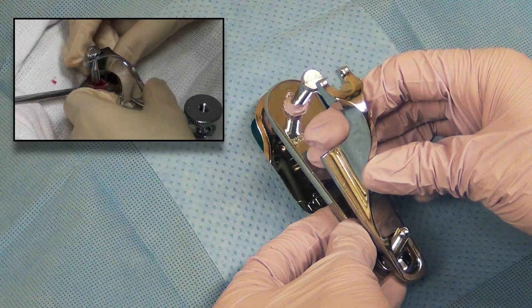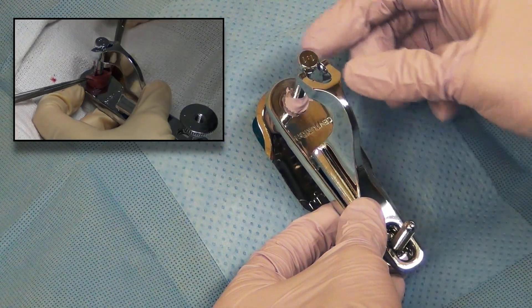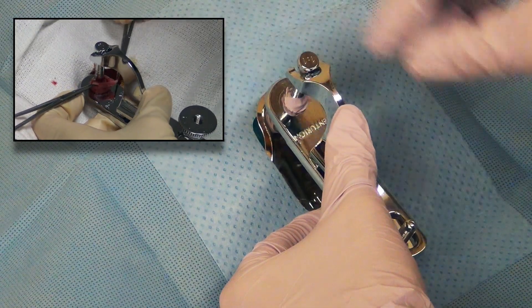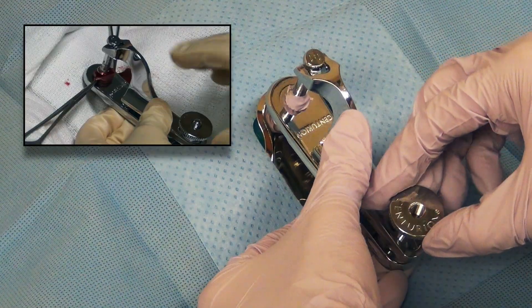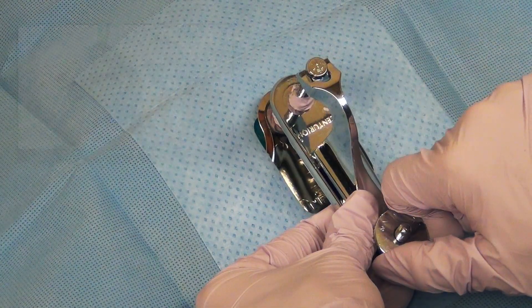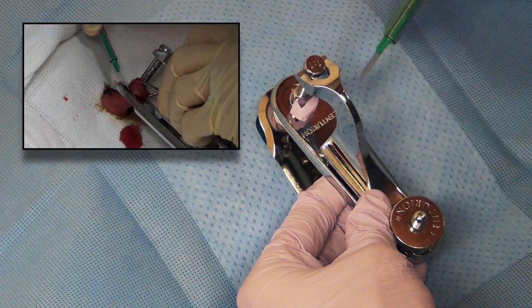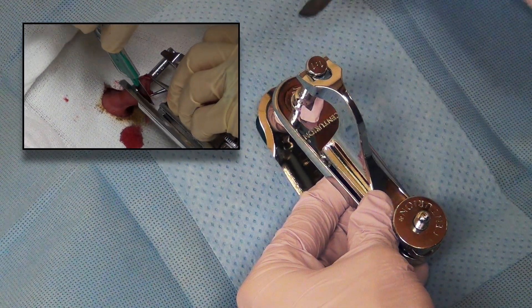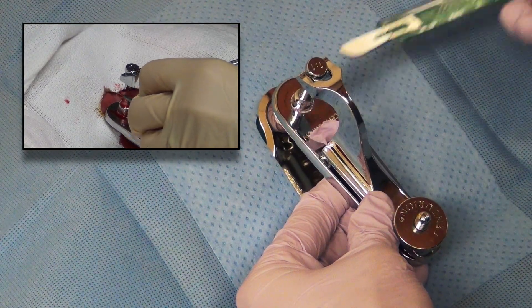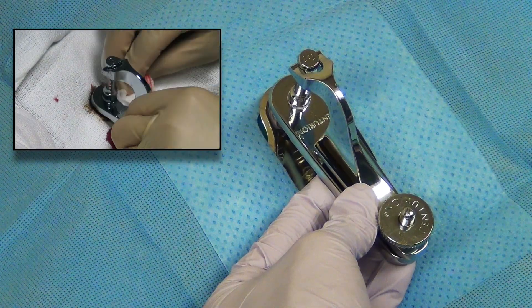The bell is secured in the rocker arm and the nut is tightened down. The foreskin is cut with a scalpel flush with the bell. The clamp is left in place for 3 to 5 minutes.